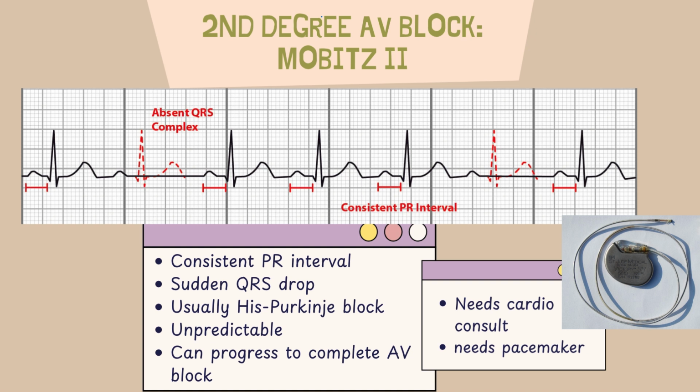If you see this in EKG, you're calling cardiology. If you are cardiology, you're doing cardiology. I'm not cardiology, so I call people.